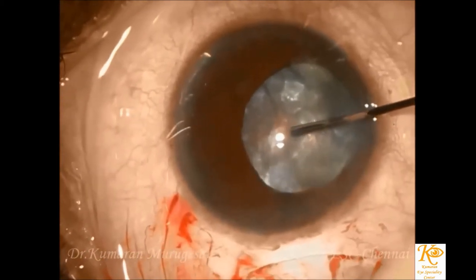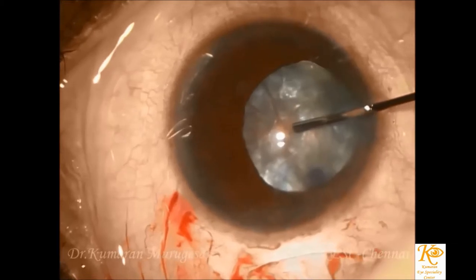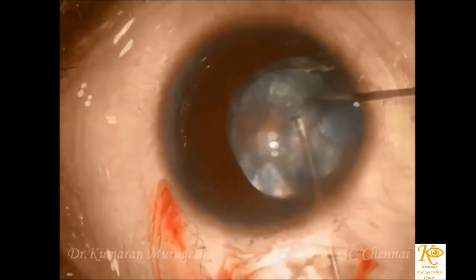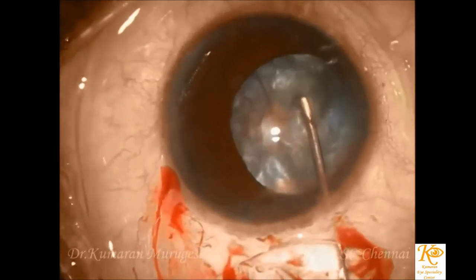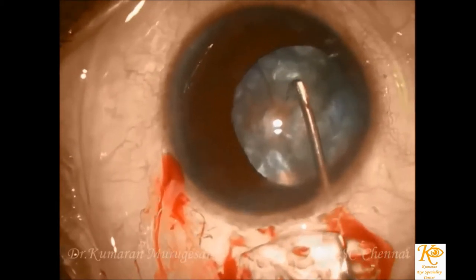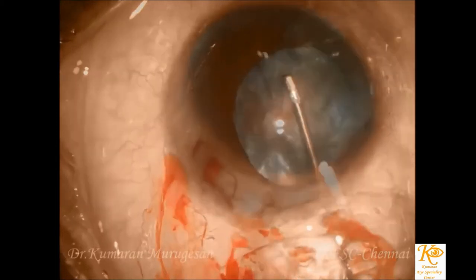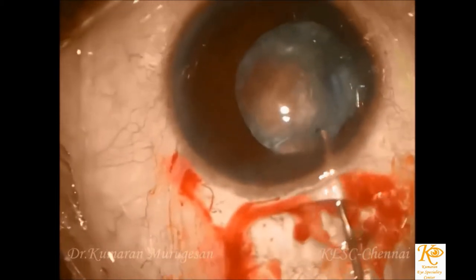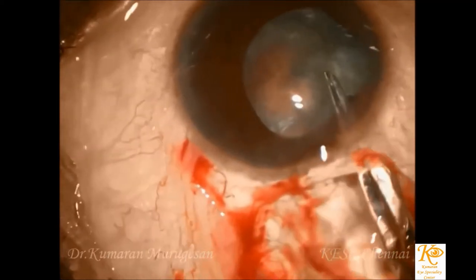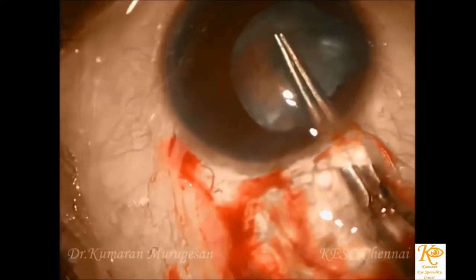After initial puncture with the cystitome, the liquefied cortex is aspirated with the 26 gauge cannula to reduce the intralenticular pressure, thus reducing the chances of capsulorhexis extension. The aspiration of the liquefied cortex can be done multiple times as needed. The rhexis is then completed with the help of a forceps.